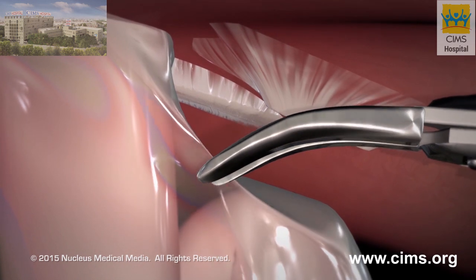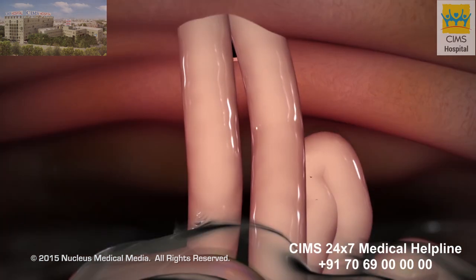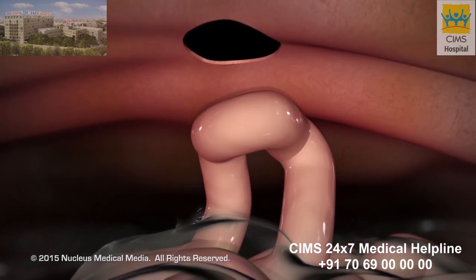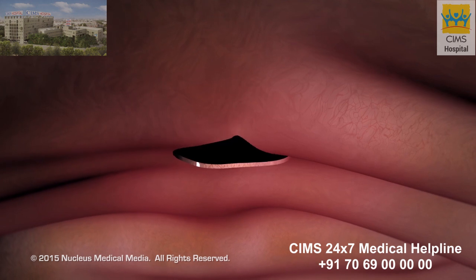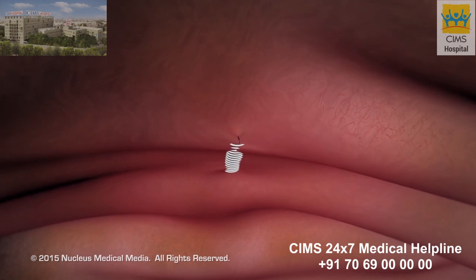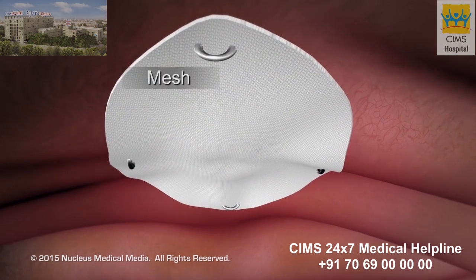Then your surgeon will cut away the hernia sac, allowing your intestine to return to its proper location in your abdomen. The hernia defect will be closed with sutures. Next, your surgeon will cover this area with a piece of mesh.